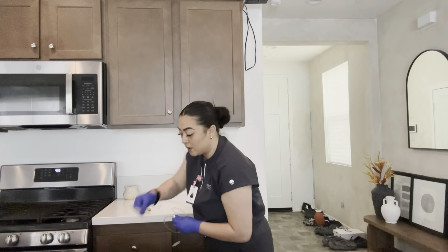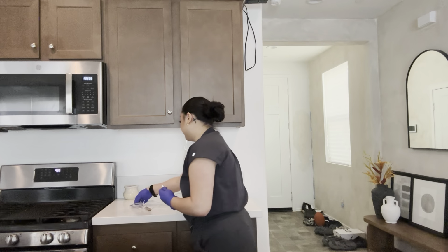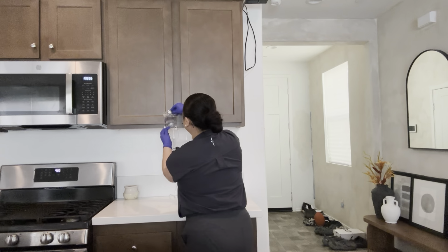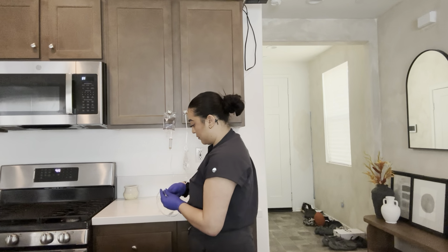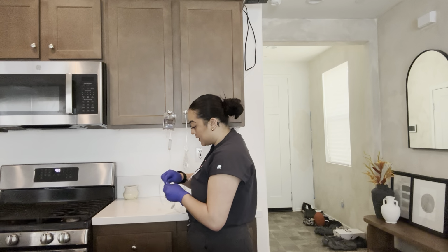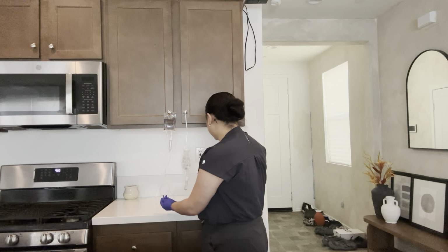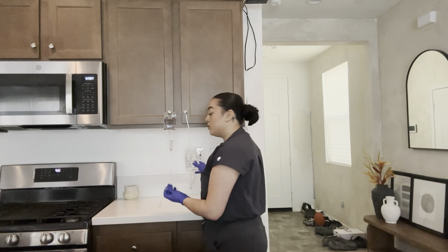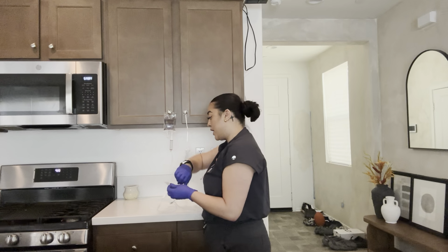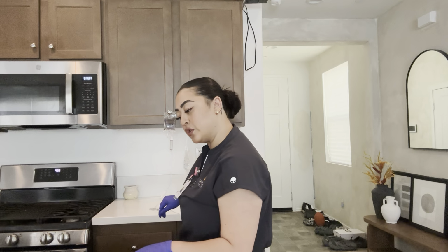So I have my alcohol swab right here. I'm gonna clean that port. I already lowered this, so I'm gonna put this right up here, ensuring that I'm not contaminating it since I did just clean it. I'm gonna go ahead and attach that Y port. And now we're gonna do the same thing that I did with the normal saline bag. We wanna make sure that it's the correct amount. So we have to time it again for 1 minute, and I did say 100 mLs.